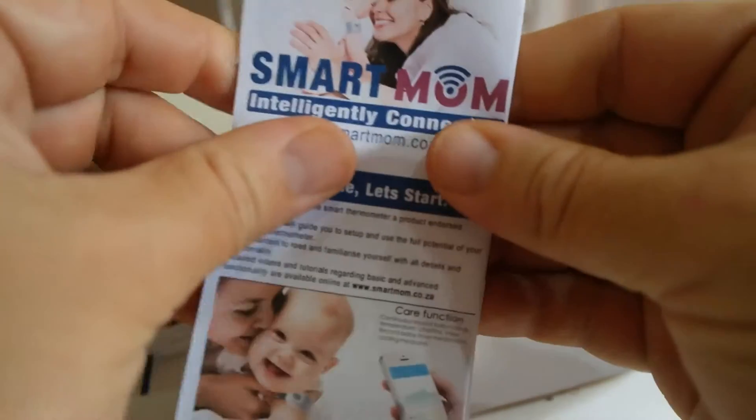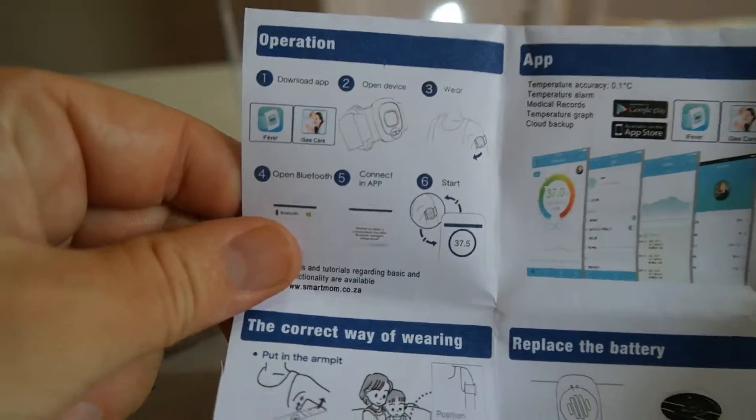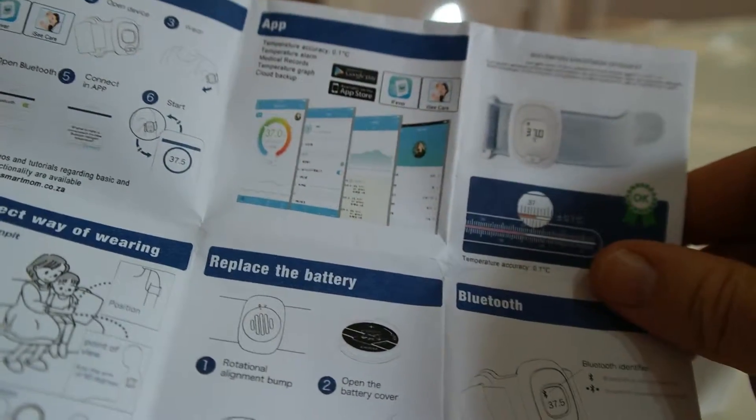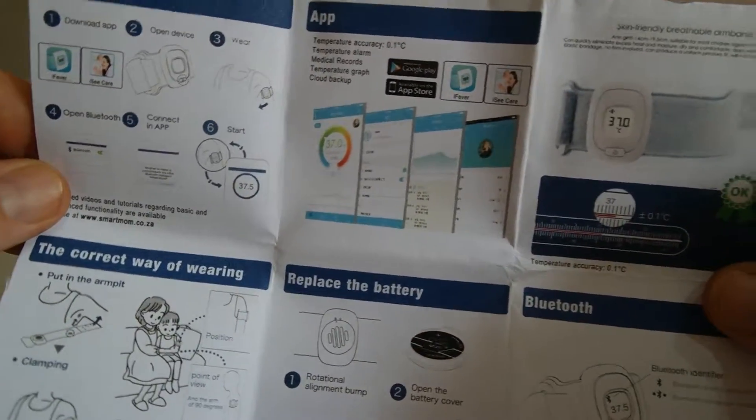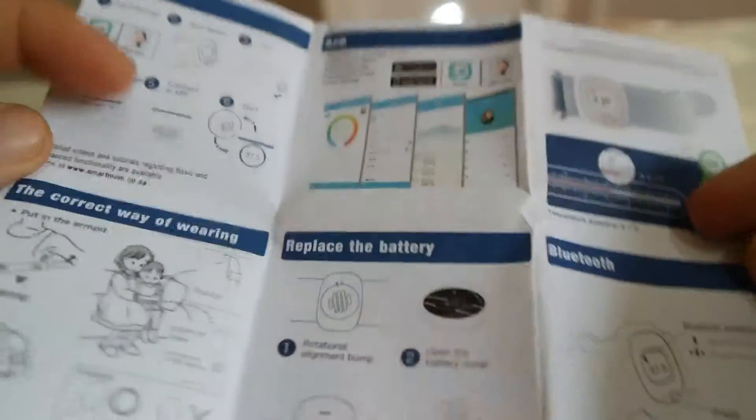Let me run you through the booklet — smartmom.co.za — with information on how to use it, how to install it, how to upload the app and use it. You can personalize or set up the app for yourself. There are two apps that you can use. Very neat.